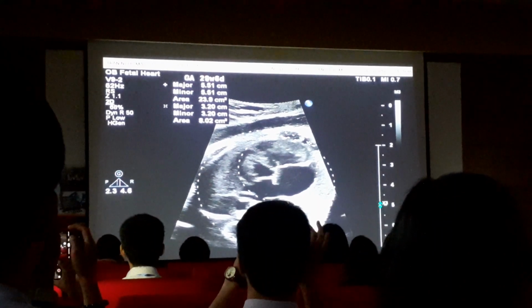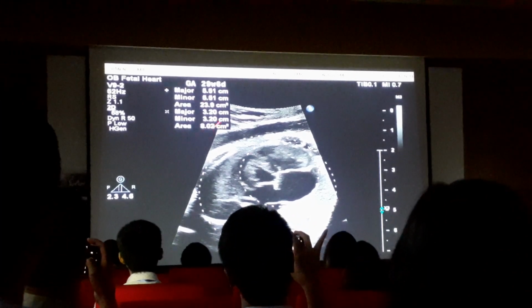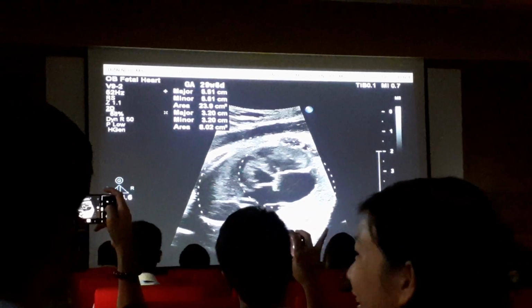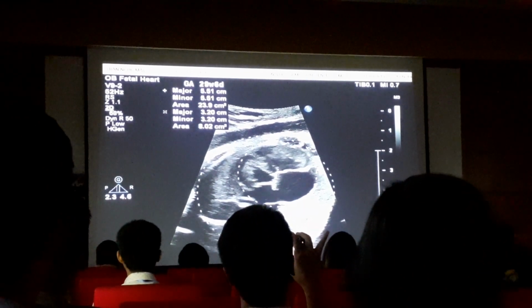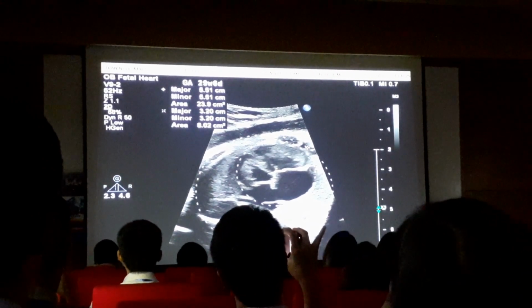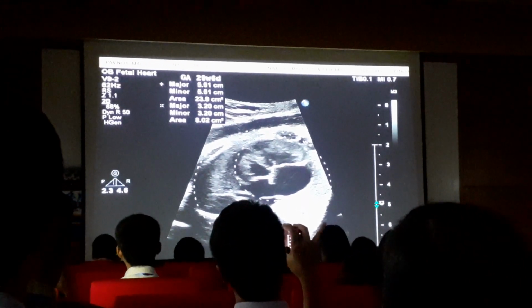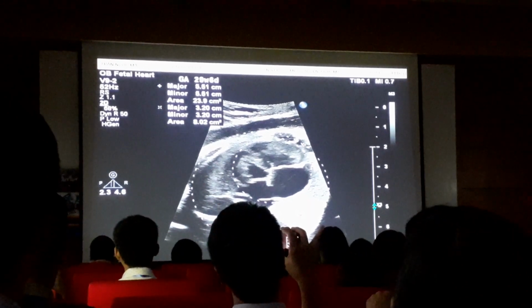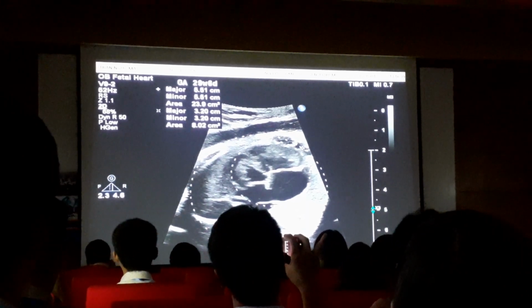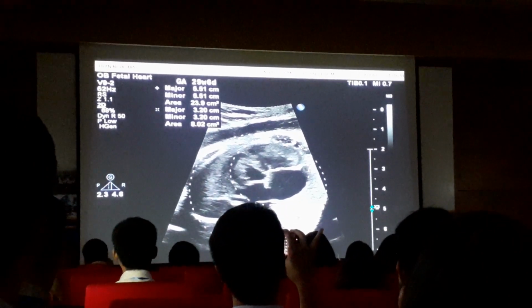So by area method, it should be 1/3, and the area ratio here is 8:23, and by circumference, it should be half. So which one's the circumference? No, there's no circumference on here. So it's just about 30%, but since my eye said that it was a little bit abnormal, I might want to remeasure just to make sure. I think I may have overestimated the thorax a little bit.